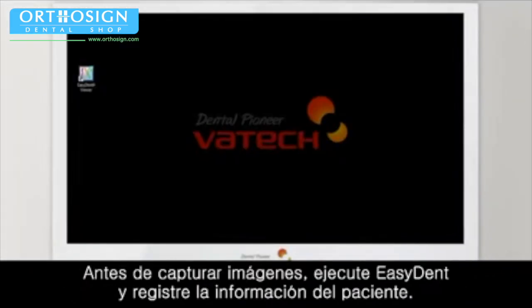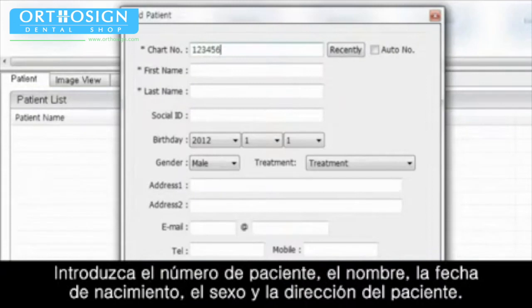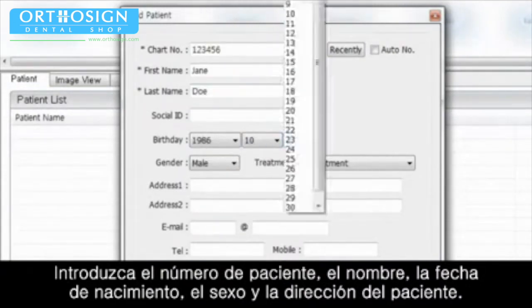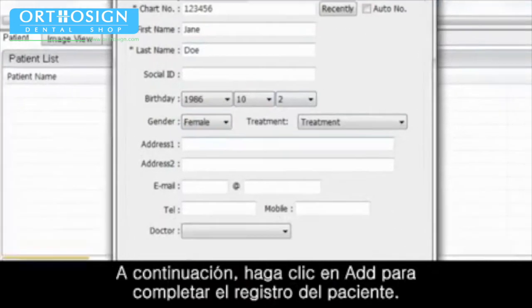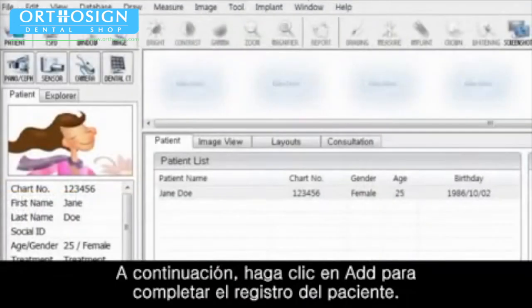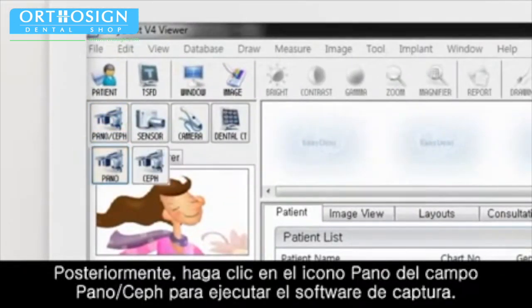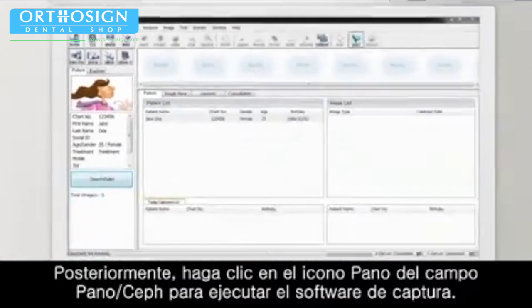Before image capturing, execute EasyDent and register the patient information. Enter chart number, name, date of birth, gender and address of the patient. Then click Add to complete patient registration. Then click the Pano icon on the Pano Ceph field to run the capture software.